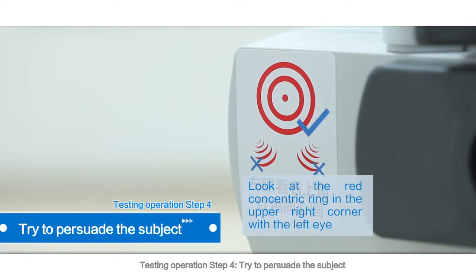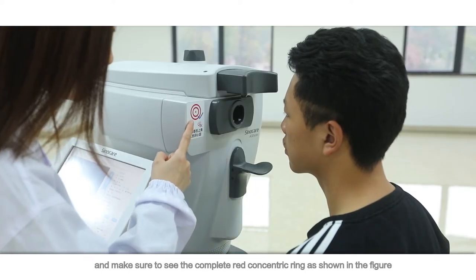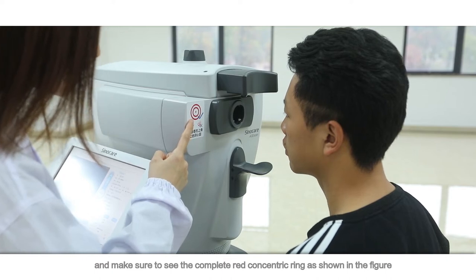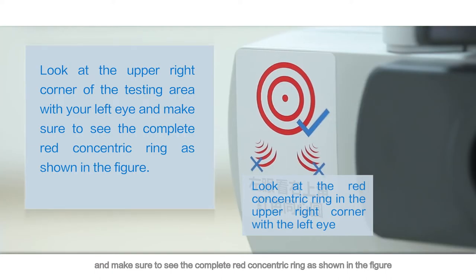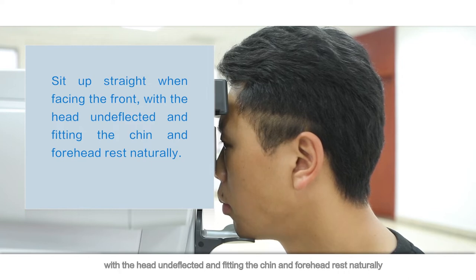Testing Operation Step 4: Try to persuade the subject. Inform the subject to take the following precautions during the test: look at the upper right corner of the testing area with your left eye and make sure to see the complete red concentric ring as shown in the figure.